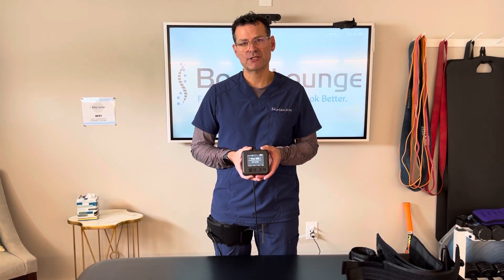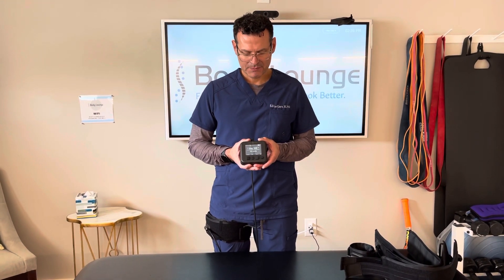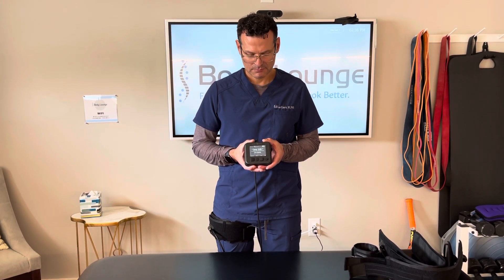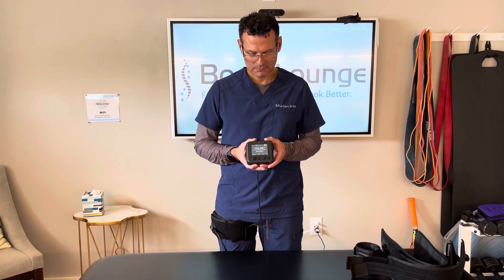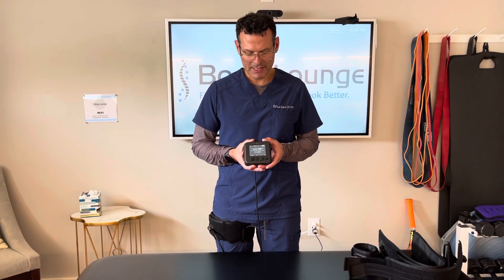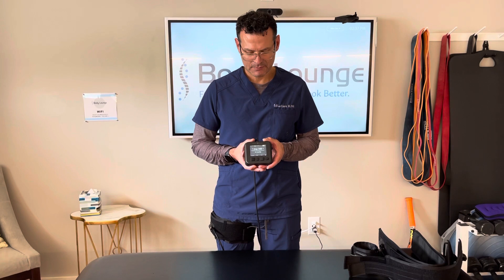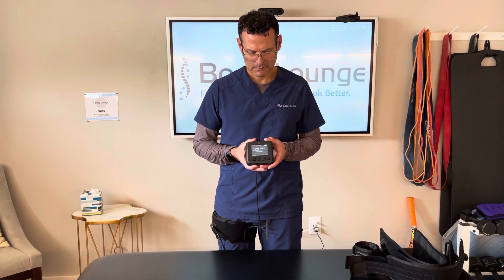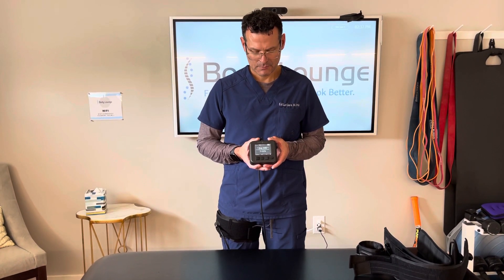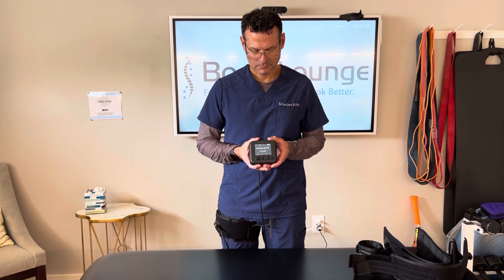This is finding it. I'm feeling a lot of pressure because it is trying to find your arterial occlusion pressure, so you try to stay really still. We're almost there. Now it totally deflates. Once it gets to a fully deflated state, then it's going to re-inflate to the appropriate pressure level.